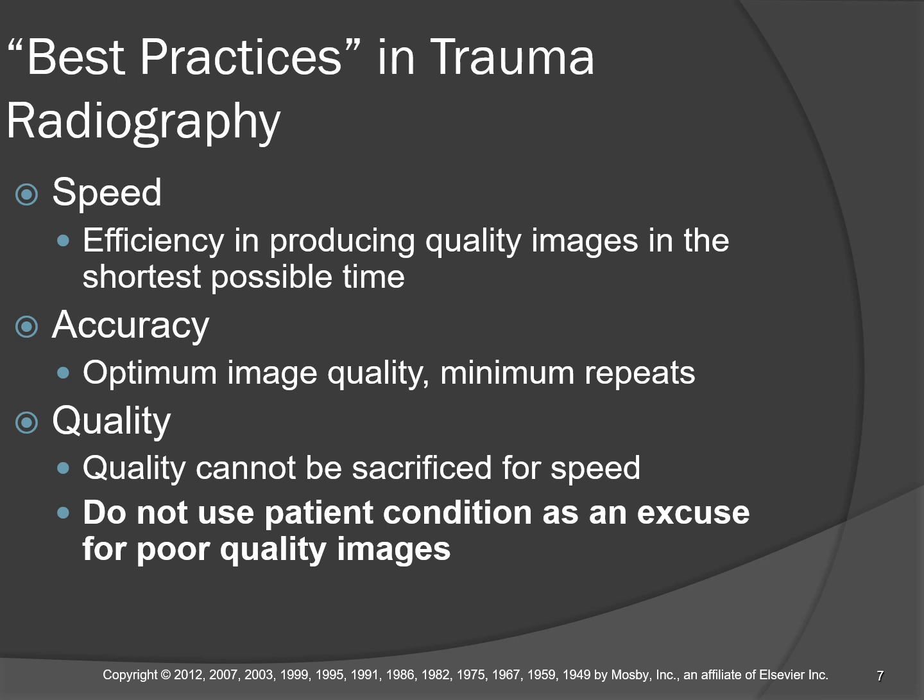Is the tube angle going to be standardized? No, that's one of the things you'll be able to adapt, along with SID and image receptor alignment. All of these changes improve image quality.